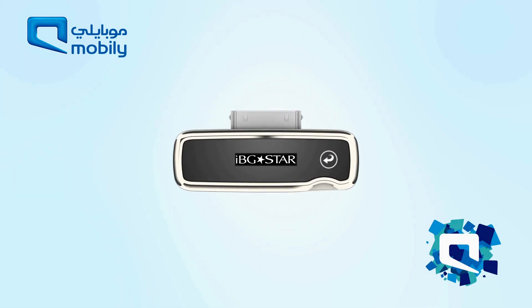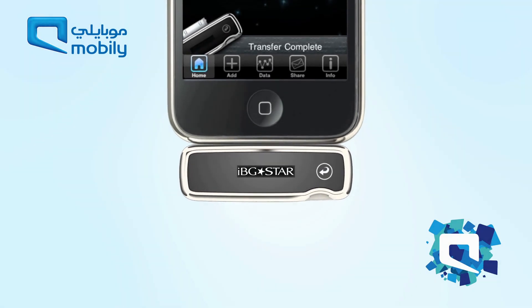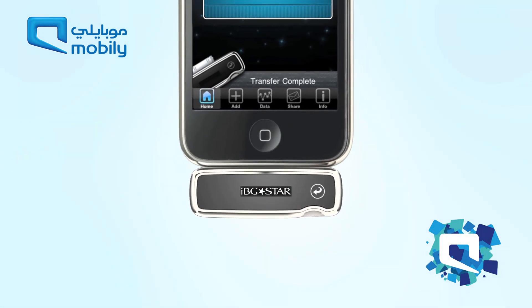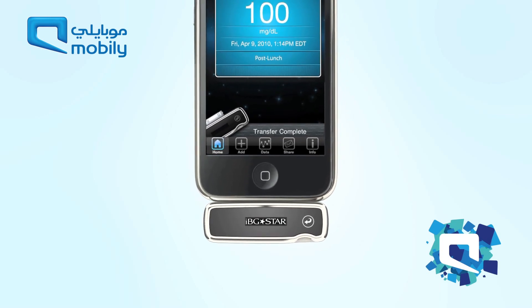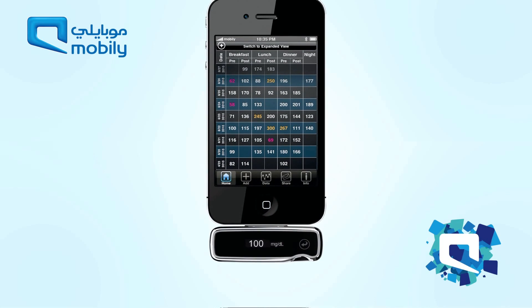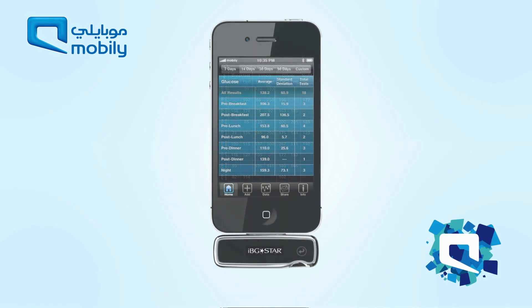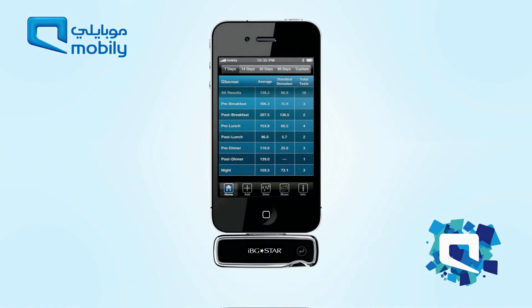IBGSTAR can also be used stand-alone to measure blood glucose levels, and synchronised to an iPhone or iPod Touch at a later time. The IBGSTAR and its Diabetes Manager app allows data to be easily displayed, managed and communicated, which helps people with diabetes and their physicians make better informed diabetes-related decisions.